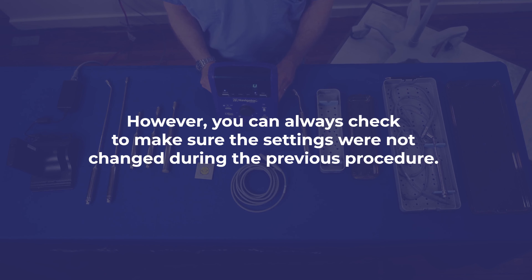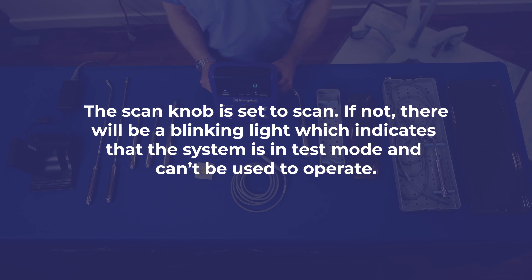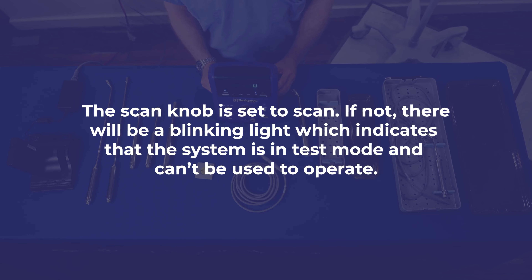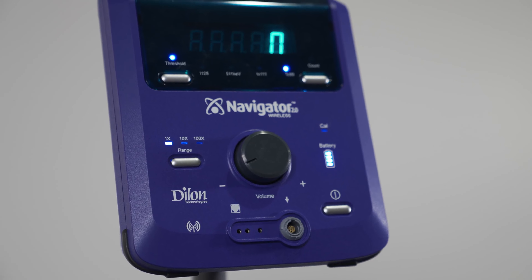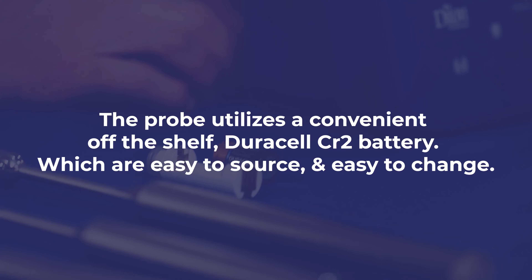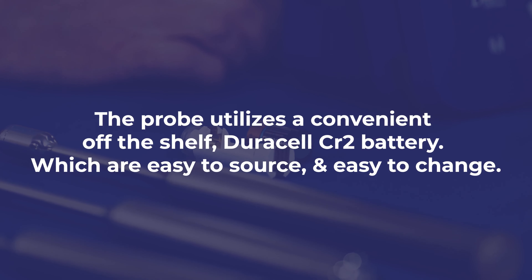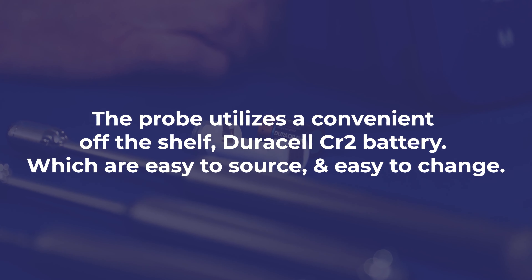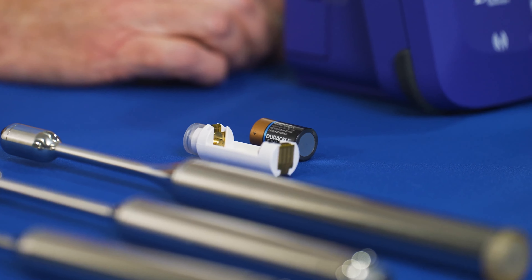You can always check to make sure the settings were not changed during the previous procedure. The scan knob should be set to scan. If not, there will be a blinking light indicating the system is in test mode and cannot be used to operate. Ensure the threshold light is on, the range is on 1x, and you are set to the desired radiation source. When turned on, the display will read zero. The probe utilizes a convenient off-the-shelf Duracell CR2 battery, which is easy to source and change. A new battery is replaced by central processing after cleaning and prior to each sterilization.